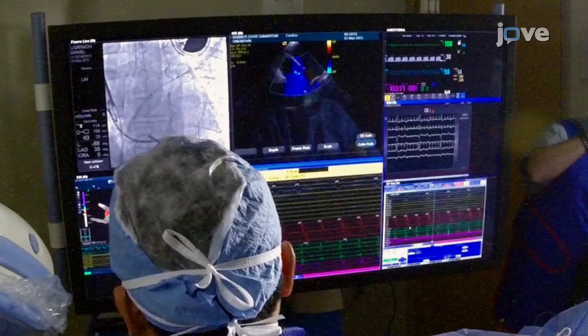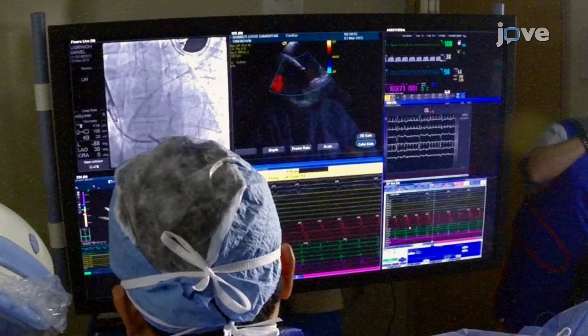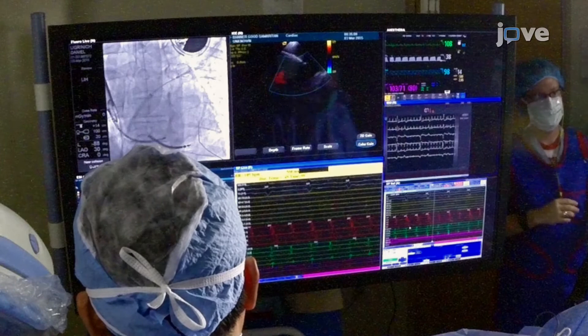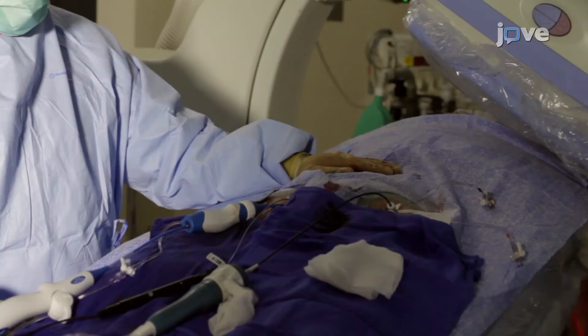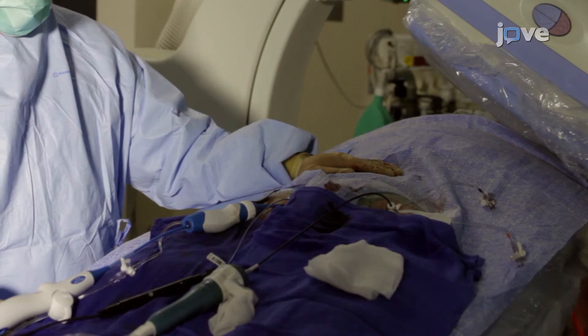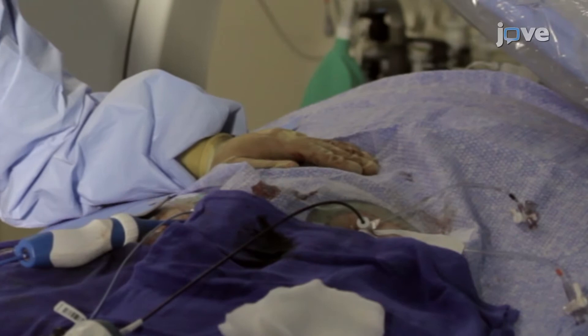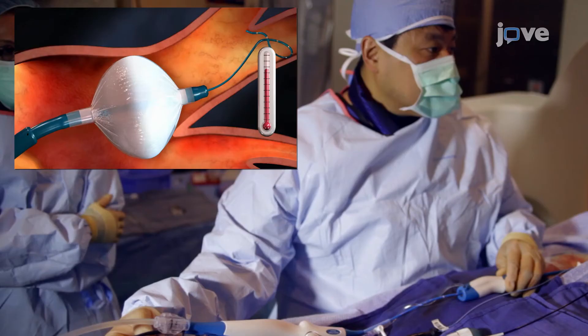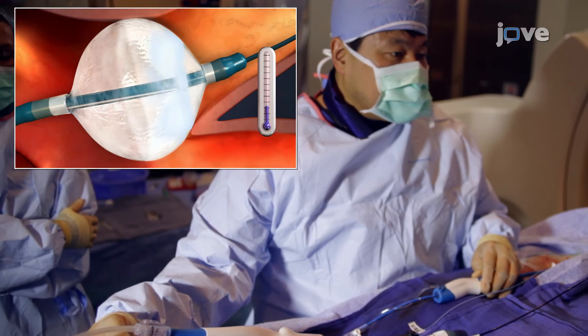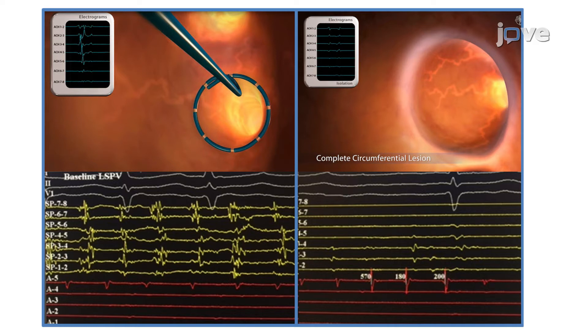Pace the phrenic nerve at 20 mA amplitude and 2.0 ms pulse width and monitor phrenic nerve function by manual detection of diaphragmatic contractions. Immediately terminate an ablation if phrenic nerve function is diminished, delayed, or lost. Deliver a minimum of 2 freezes, each lasting 120 to 180 seconds, while using the inner lumen circular mapping catheter to monitor both real-time and post-ablation PVI through entrance and exit block testing.